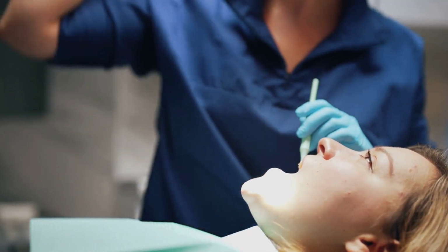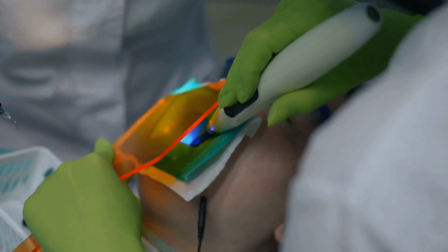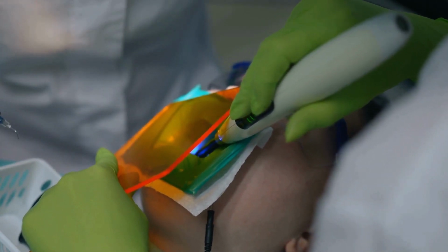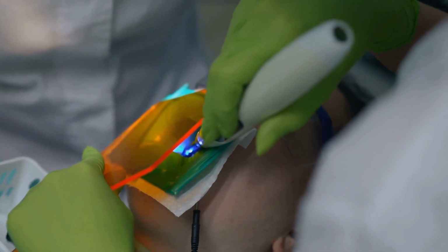For instance, early signs of dental caries, often characterized by subtle changes in enamel texture and color, can be difficult to detect with the naked eye or through conventional photography. The demineralization process that leads to caries alters the optical properties of the enamel, creating subtle variations that are readily highlighted by cross-polarized light. By capturing these variations, cross-polarized photography allows dentists to identify early carious lesions, enabling timely intervention and potentially preventing the need for more extensive treatment in the future.